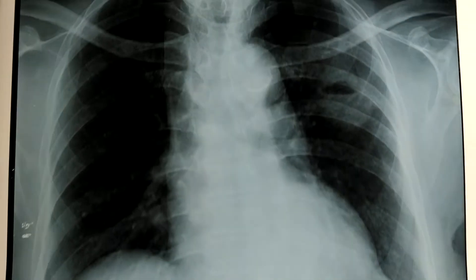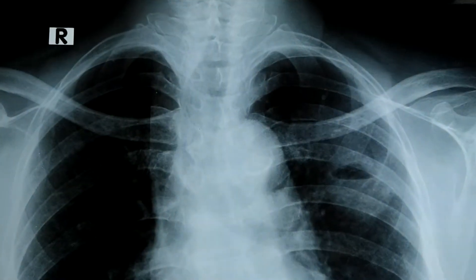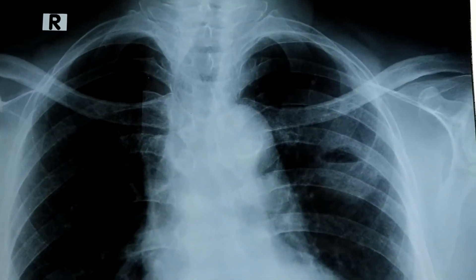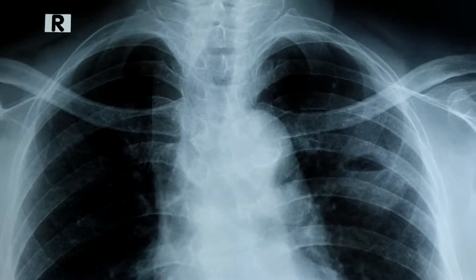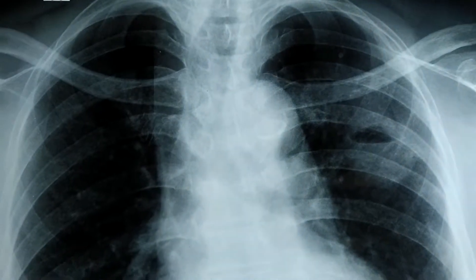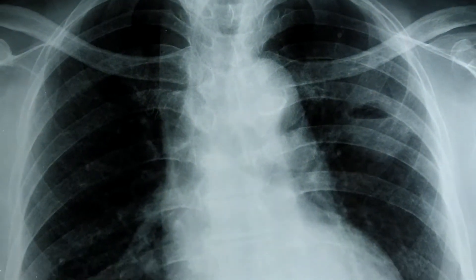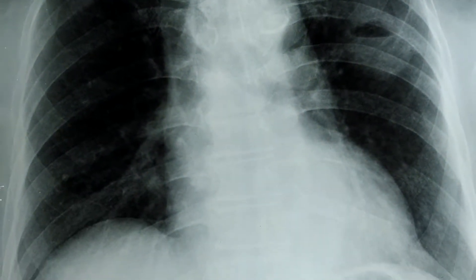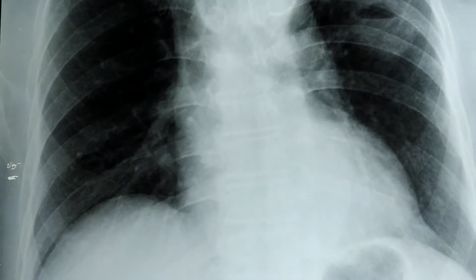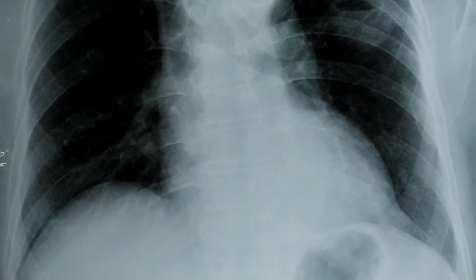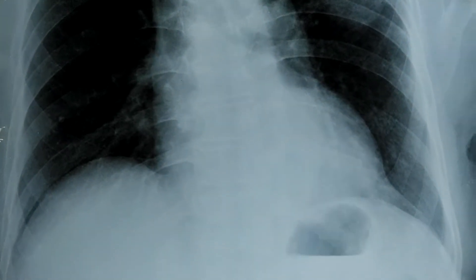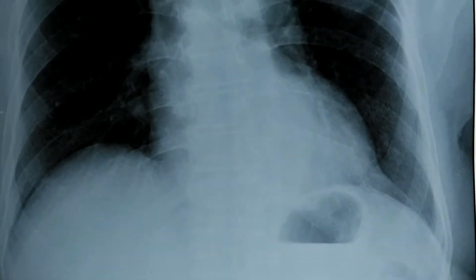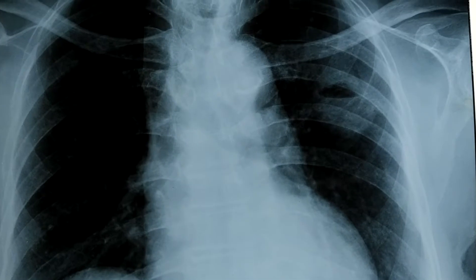This is the X-ray chest PA view showing that the trachea is almost central in position, with a normal cardiac silhouette. The costophrenic and cardiophrenic angles of both sides are quite normal, with a normal fundal shadow.